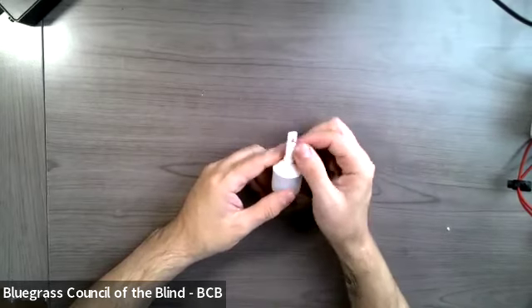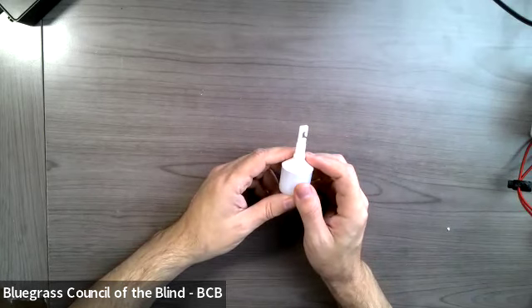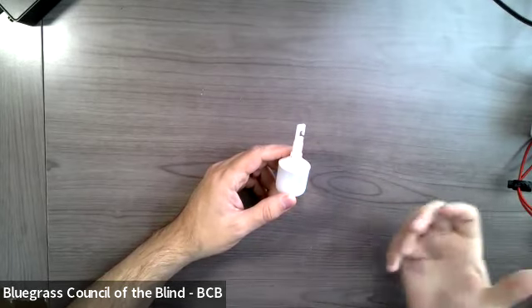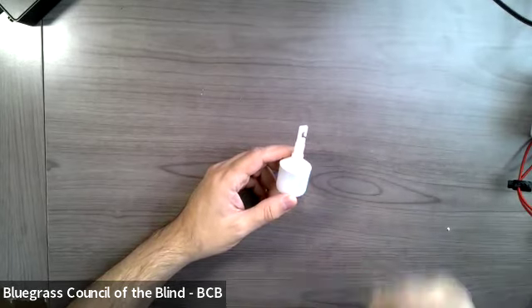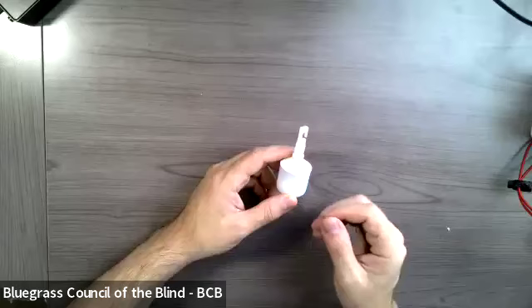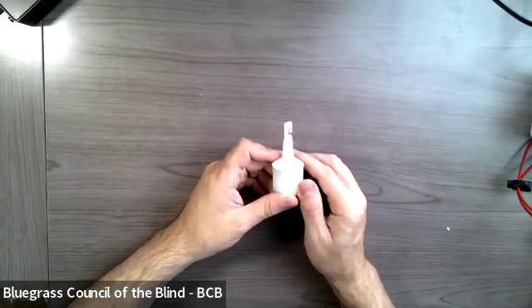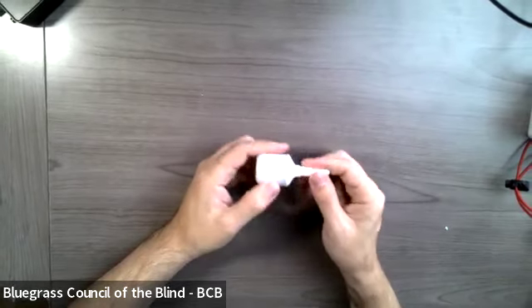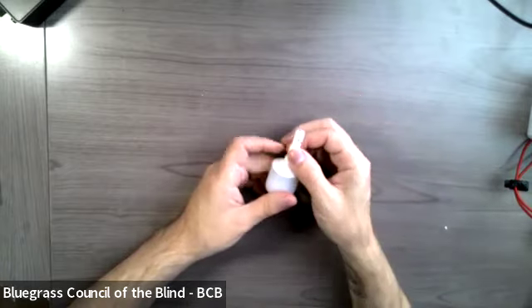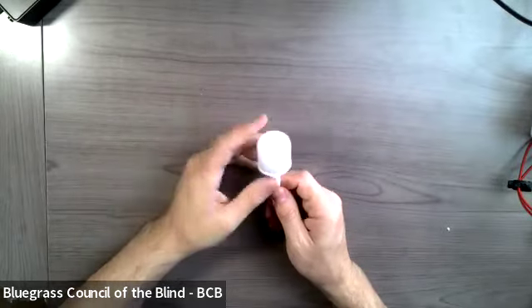But one thing you'll notice is the other end here. This is called a hook style tip. And depending on which cane you get, yours might require a hook tip, yours might require a slip-on tip, or yours might require a screw tip with an 8 millimeter threaded screw end. So it's just important to know which kind of cane you have. It depends on which kind of tip you want to get. But each of those different styles of tips or categories of tips, hook tips, slip-on tips, screw tips, will have all the different styles of tips available, which is great.